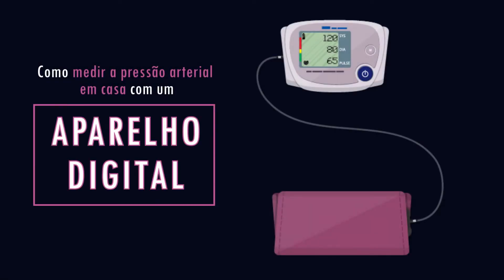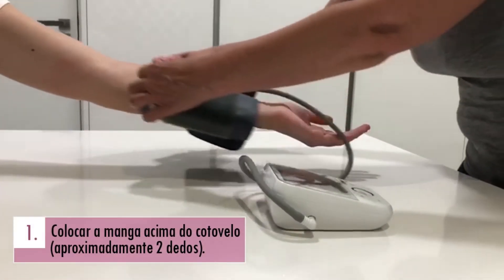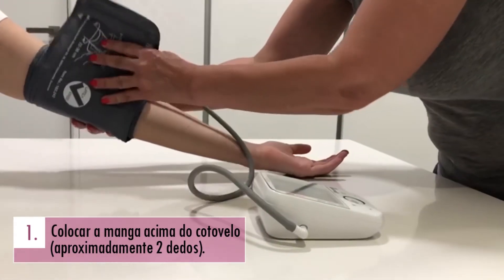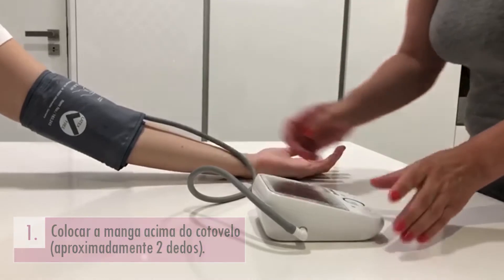Como deve medir a pressão arterial com o aparelho digital? Coloque a manga aproximadamente dois dedos acima do cotovelo. Deve manter-se sentado, com as pernas descruzadas e sossegado.